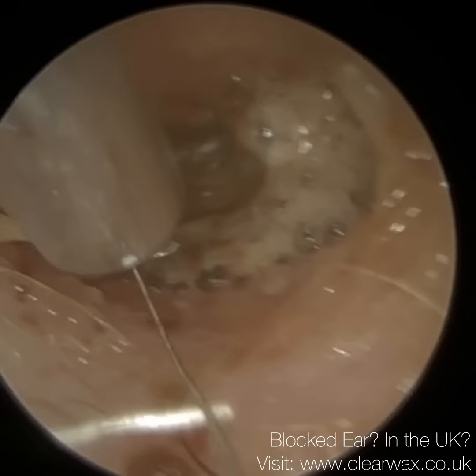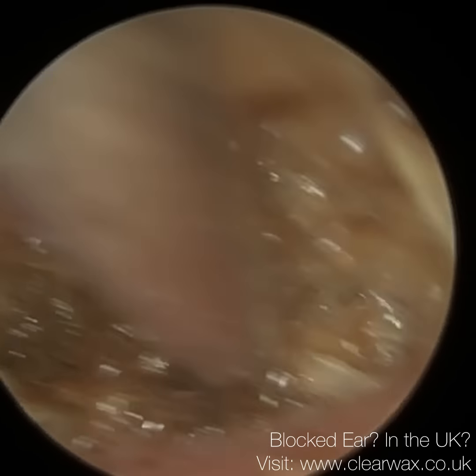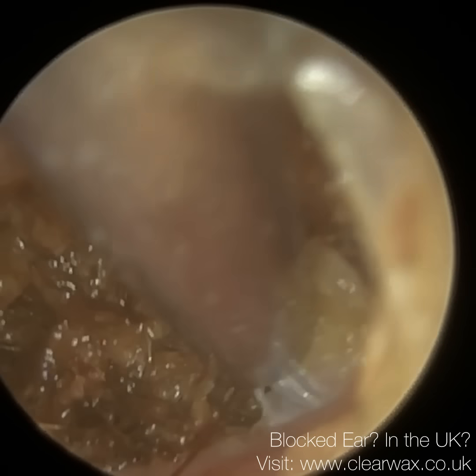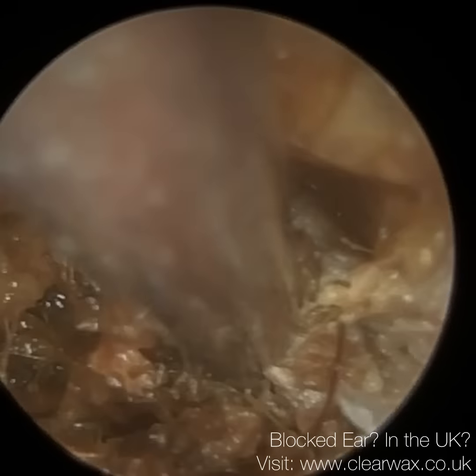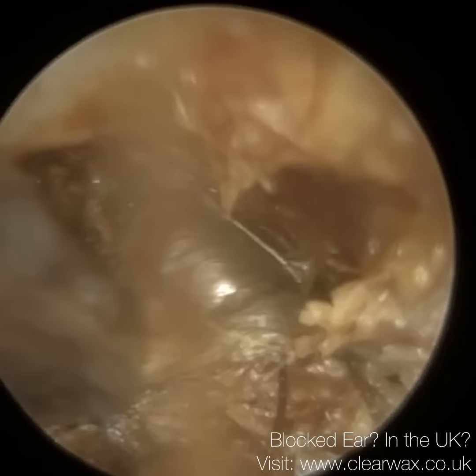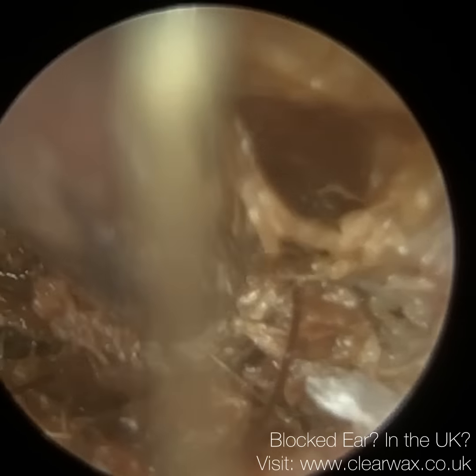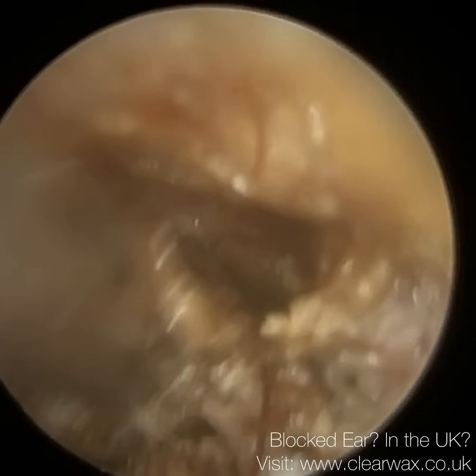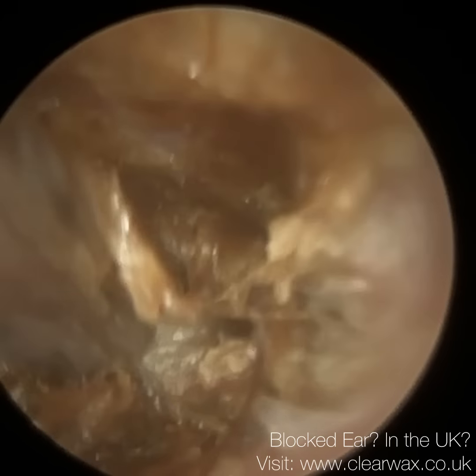With keratosis obturans, olive oil isn't really helpful. It just hits the surface and kind of drains back out. It doesn't really penetrate. And here we want to break up this plug a little bit. Hydrogen peroxide doesn't dissolve, but it does help to break up. Now, in the UK, hydrogen peroxide is not readily available.